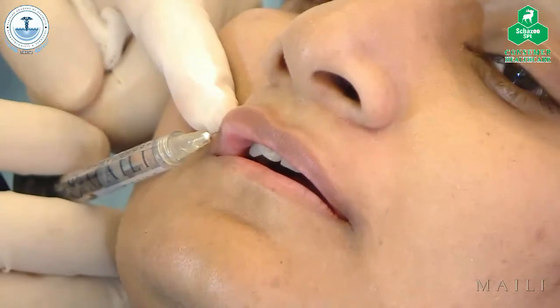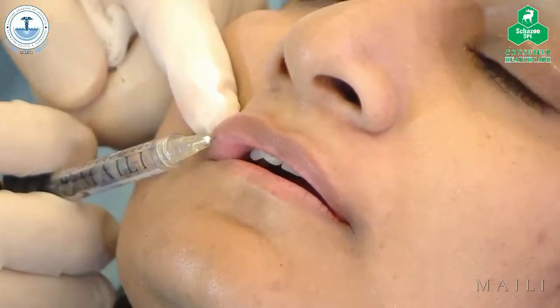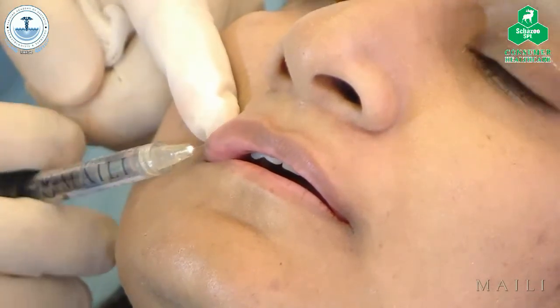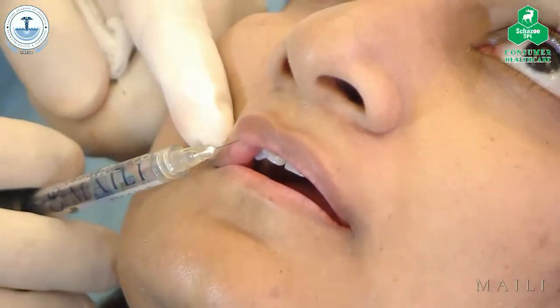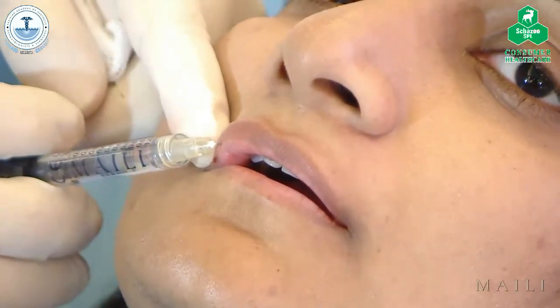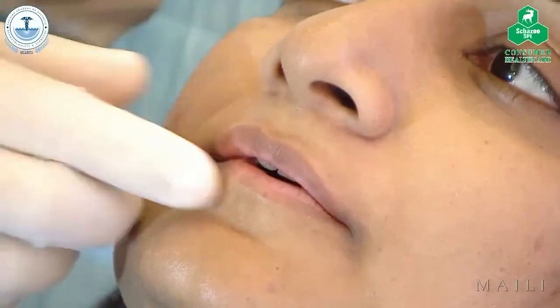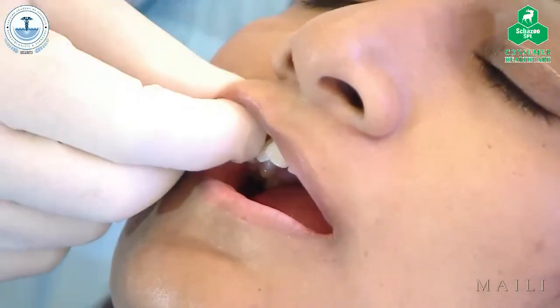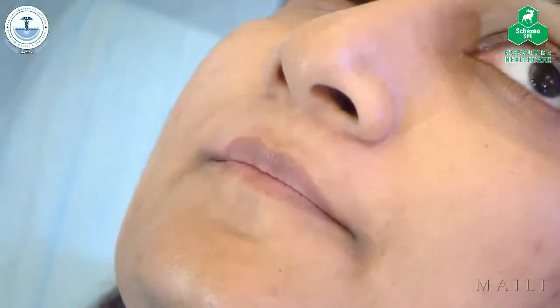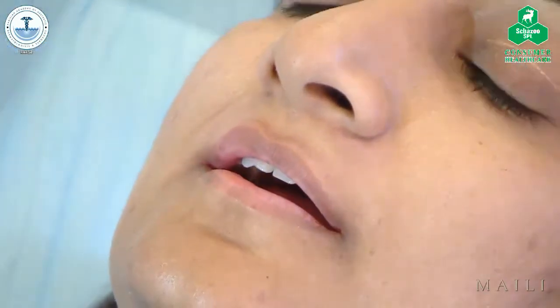Small prick. And just 2 lines here. And another 2 lines. Okay, again, 0.1. So you're adding support under the muscle, and then you're adding volume over the muscle. Yes, that's pretty much it.